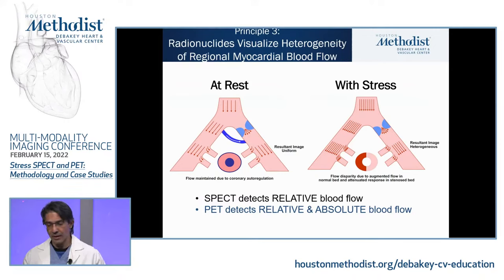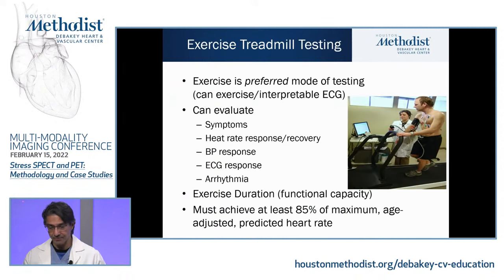Now, an important point I'll emphasize here and later as well: SPECT detects relative blood flow differences, whereas with PET, you can also detect absolute blood flow differences.